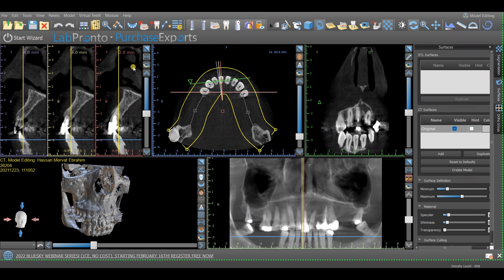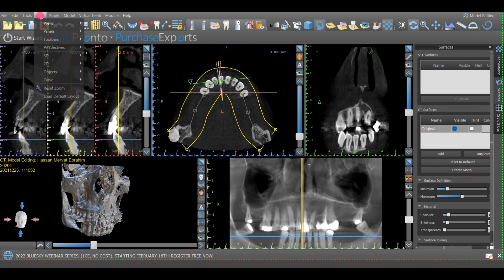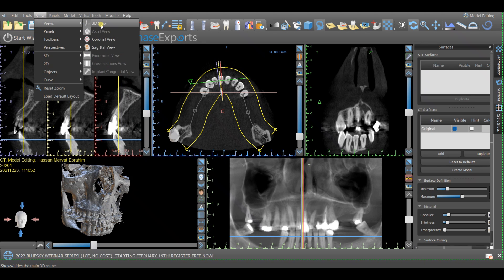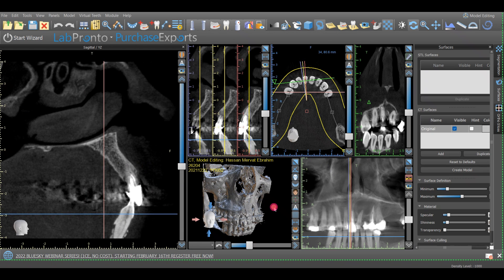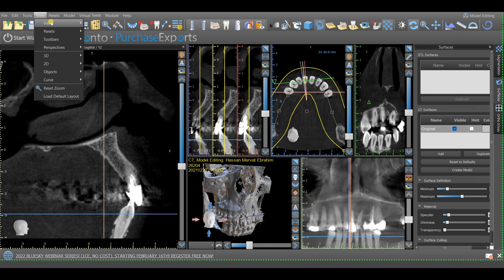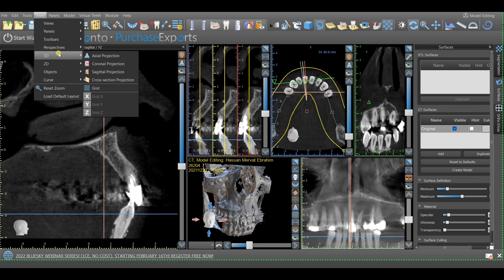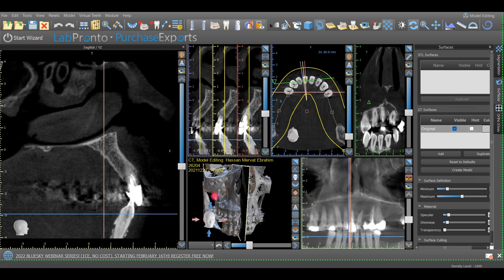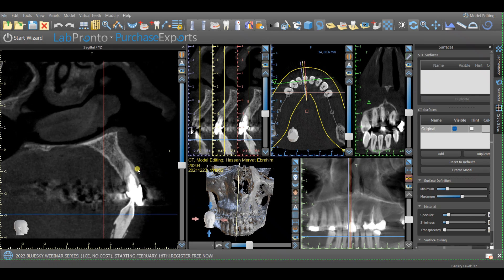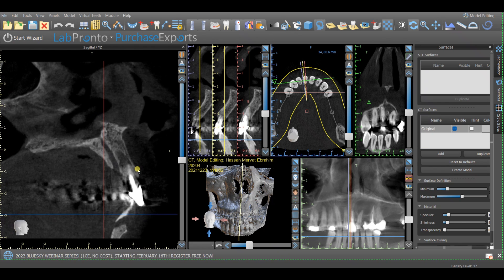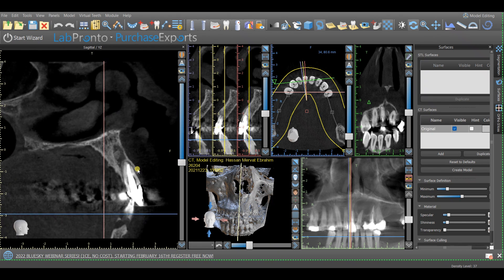Let's see the sagittal plane, or the sagittal view. As mentioned, it divides the body into right and left. To explain it, we will go to View > 3D sagittal projection. It will basically start in the midline, and we are moving right and left.